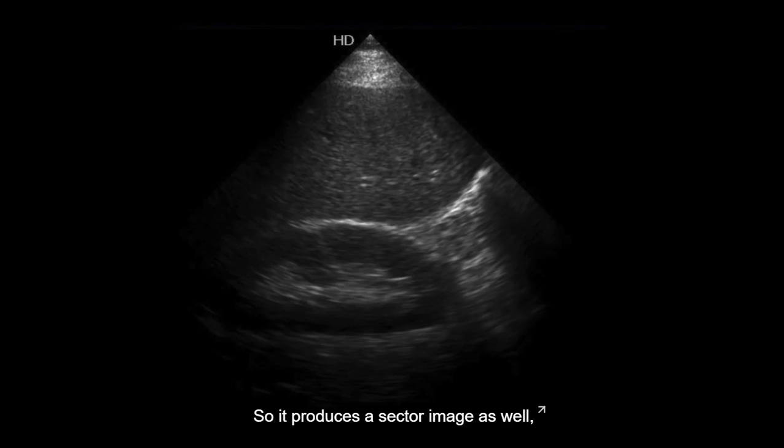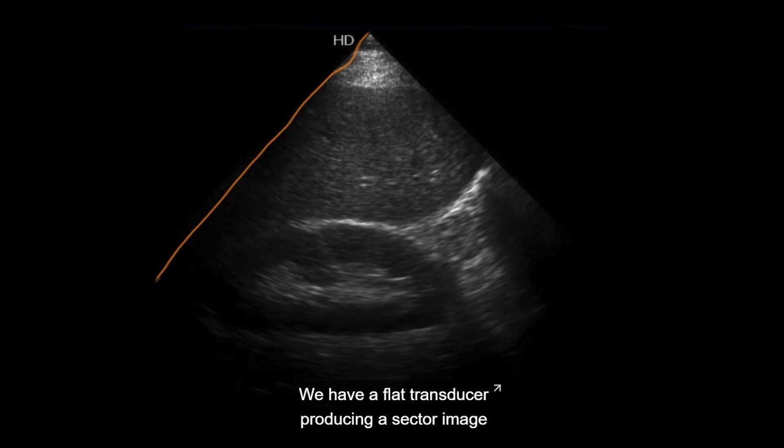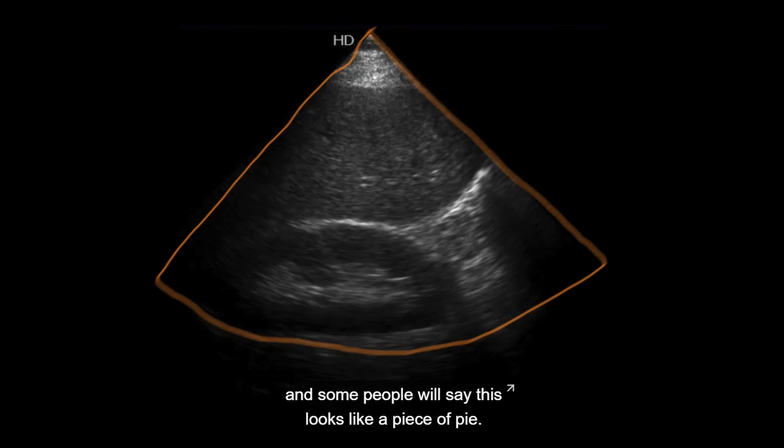So it produces a sector image as well, but you'll notice something different from this sector image. We have a flat transducer producing a sector image that comes to a point. And so people will say this looks like a piece of pie. Well, why does it come to a point right here?